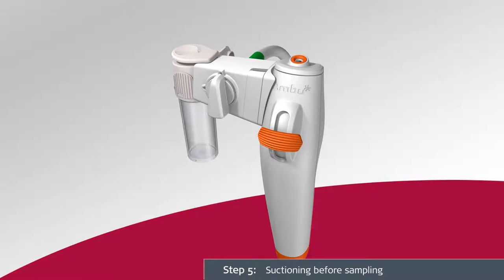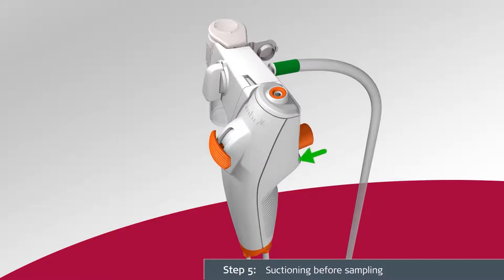To suction before sampling, ensure that the flow switch is aligned vertically and pointing upwards. This is the default position after being removed from the package. Perform suction by pressing the suction button on the A-Scope IV Bronco in accordance with the instructions for use for the A-Scope IV Bronco.